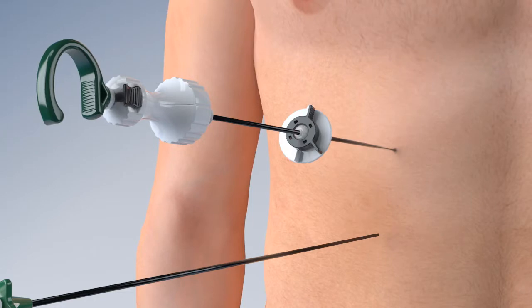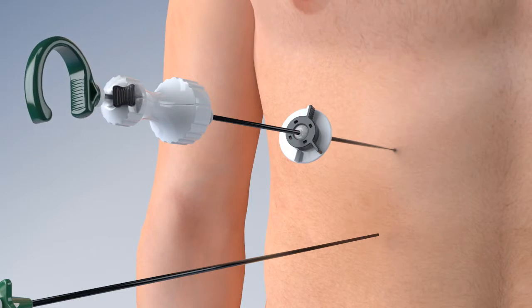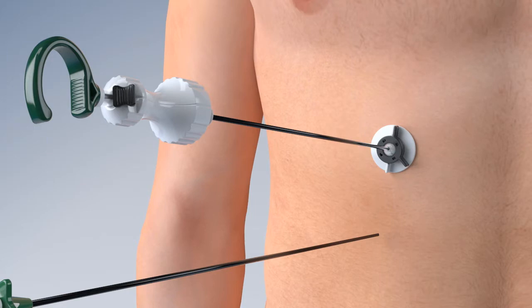The jaws can be locked onto the tissue and extracorporeally the stabilizing pivot disc can be locked for hands-free retraction at the distance and angle you desire.